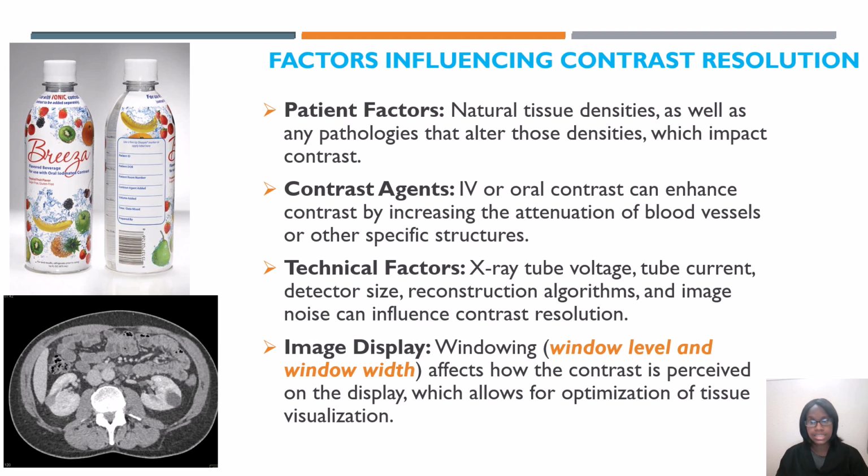Because if you do not tell them these instructions, then they are going to sip on the contrast for about an hour to 3 hours. Keep in mind, sometimes whenever people come in for these scans, they take off from work. So they're looking at it like, I have all day to drink this. They may not like the taste. So you have to let them know if you don't drink it fast, then it's not going to give a good study because there's a time limit.